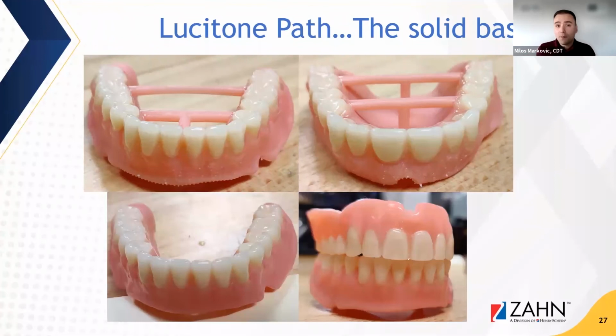A lot of people are skeptical with digital dentures because they wonder what processes do I need, what steps do I need to take. I'm not really sure. In reality, the steps of gathering the data haven't really changed much. That's mostly the same. It's more on the manufacturing side that you're really saving time and you're getting a much more solid product with dentures. It's very labor intensive finishing dentures. And so here we have an example of some of those finished dentures.